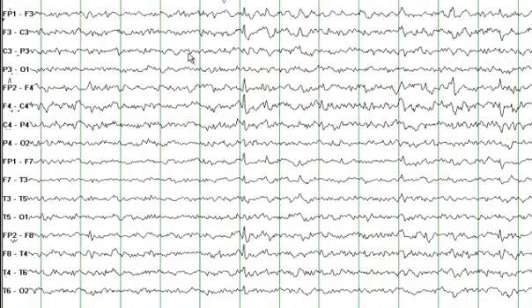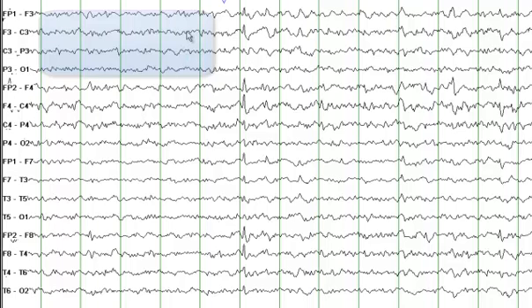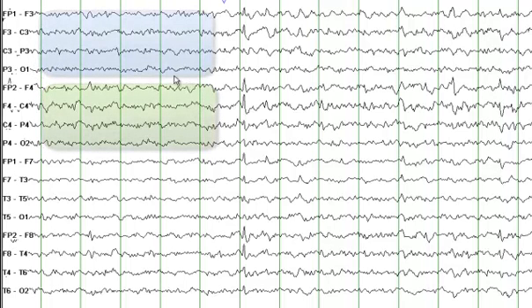In this EEG, we do not see a clear posterior dominant alpha rhythm. A striking finding is some asymmetry that we see between the left hemisphere and the right hemisphere. You may notice that there is more slowing in this region as compared to the left hemisphere.